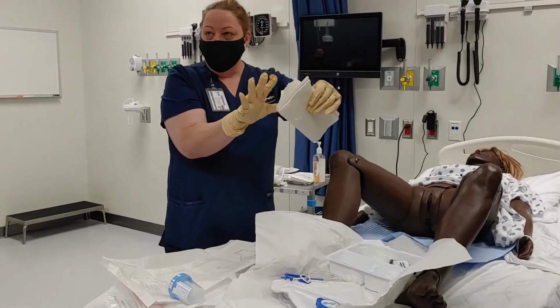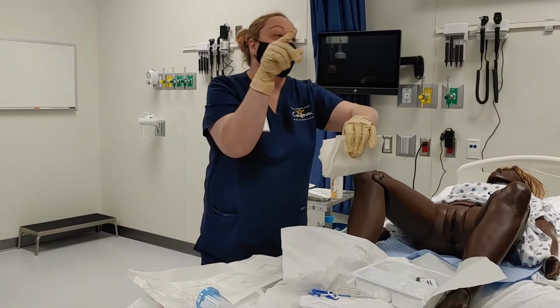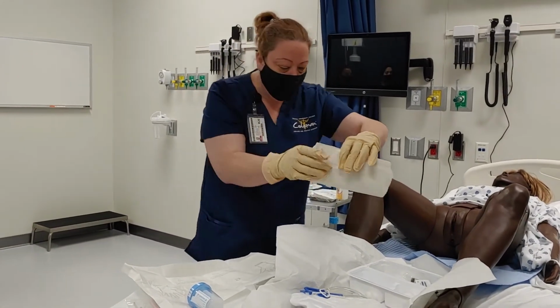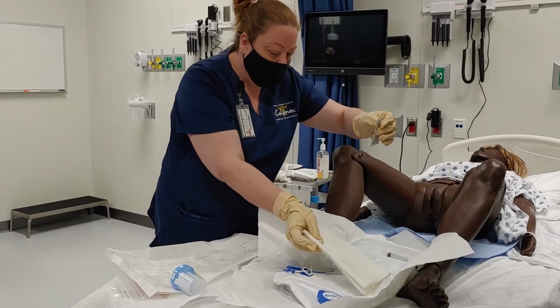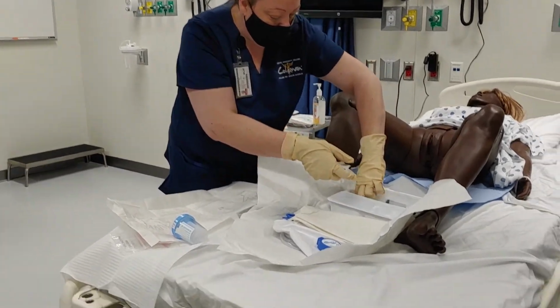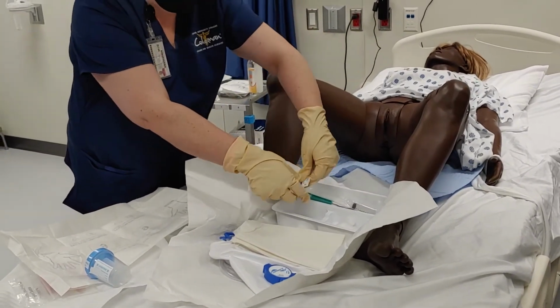This is actually a fenestrated drape. Does anybody remember what fenestrated means? It has a hole in the middle, and that's what we're going to expose the area we're going to be working with. Okay, then we have some lubricating gel. So I'm going to open this up, and I'm going to squeeze it out here. I actually have another one, and I'm going to do the same thing.